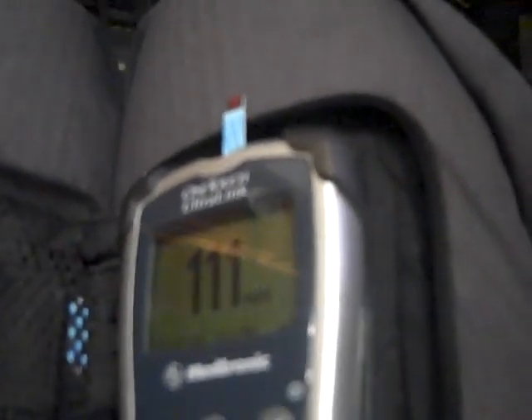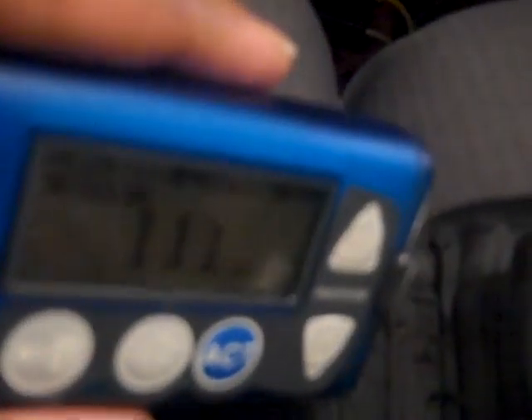Now this thing flashes when it stops — that means it sent the signal to my insulin pump. This meter sends a signal to my insulin pump. I have to show you, because you see where it says 111 right there? If you look at the insulin pump, you can see the insulin pump also says 111. It actually sent the signal from here to here — it's like a little radio transmitter built into this glucose meter. Interesting technology.